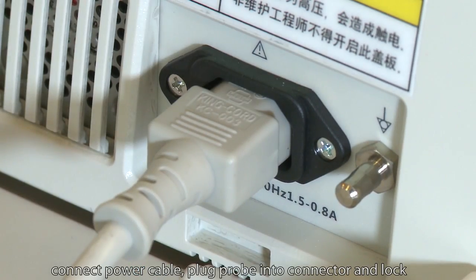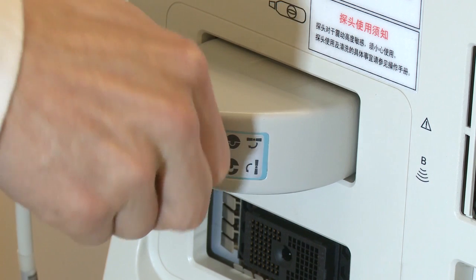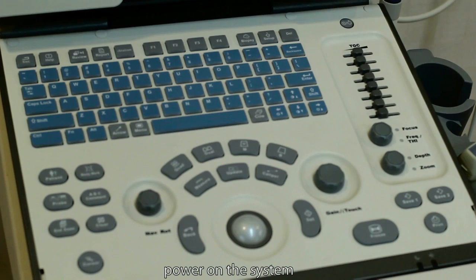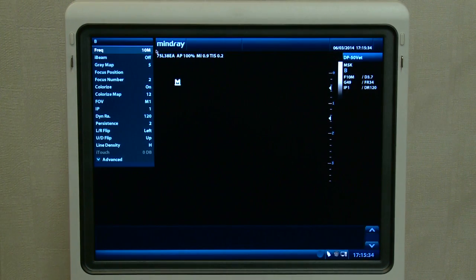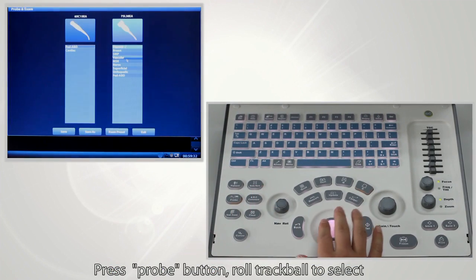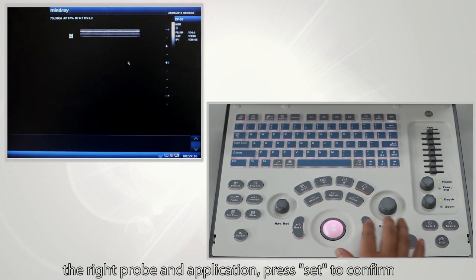Connect the power cable. Plug the probe into the connector and lock it. Power on the system. Choose the right probe according to application by pressing the probe button. Roll the trackball to select the right probe and application, then press Set to confirm.